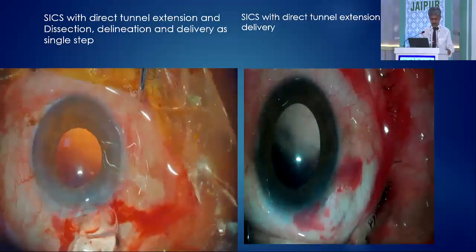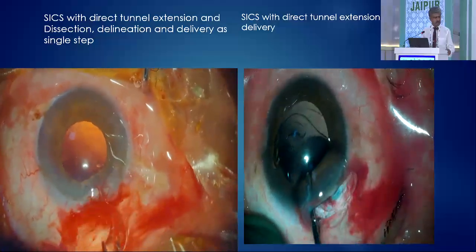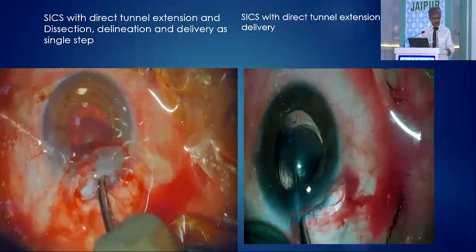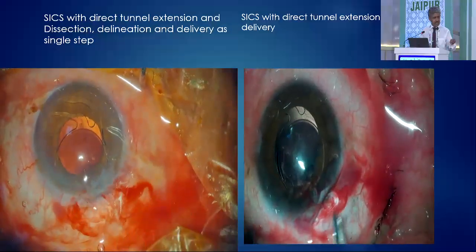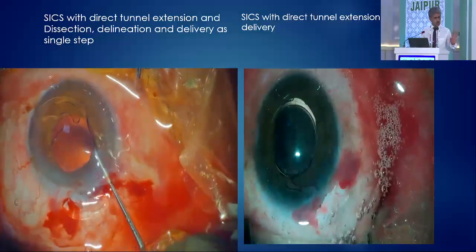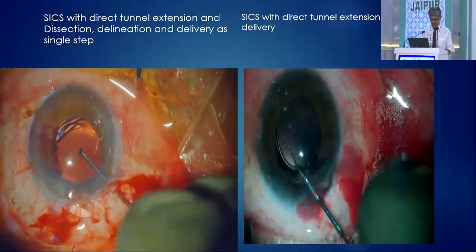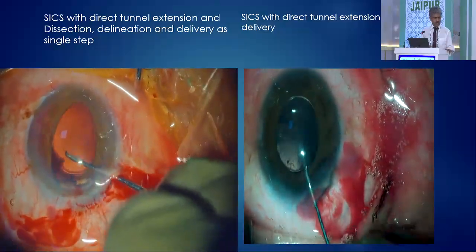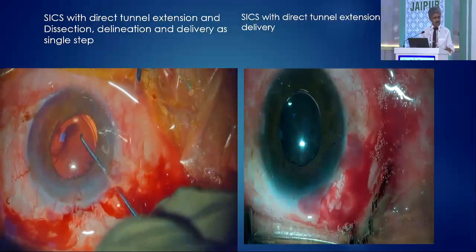And if it is a foldable IOL, then it can also be implanted, although it springs back. You can put it by injector, but many times these cheap IOLs spread from the center and crack inside it. So it's better to push them, not to take the risk of putting them into the injector system. That's why these IOLs have been routed, and I directly implanted. Slightly difficult, it springs back, but it works well.